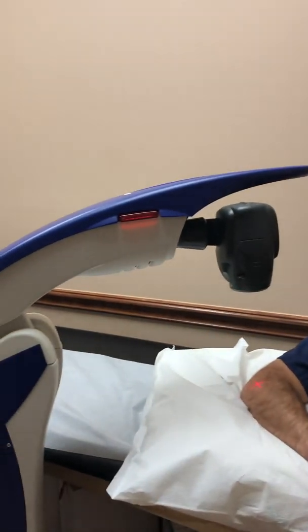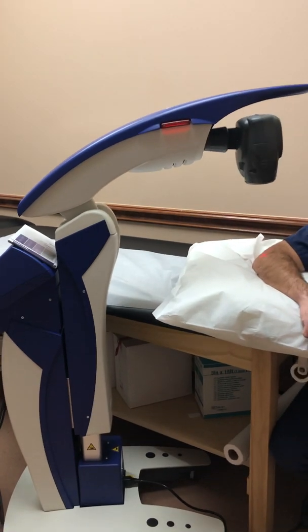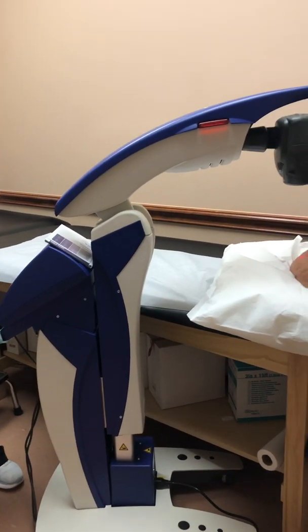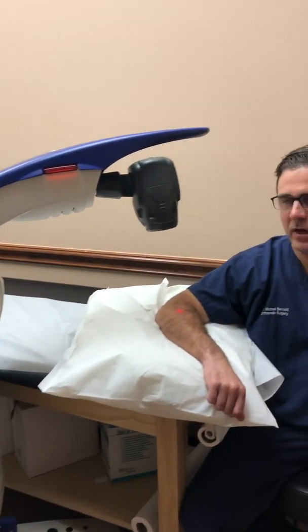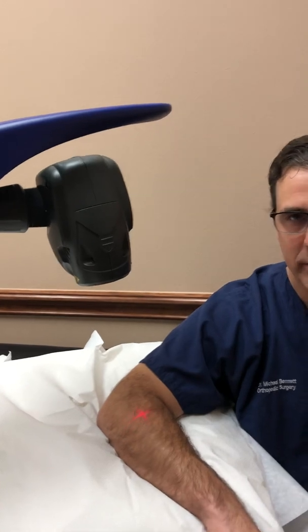I wanted to go over a little new bit of technology we have here in the office that we're going to be offering for our patients. It's the latest and greatest in regards to cold laser therapy — this is the MLS robotic laser. Right now it's actually mapping out my elbow, where I'm going to be one of the first guinea pigs to treat my tennis elbow.